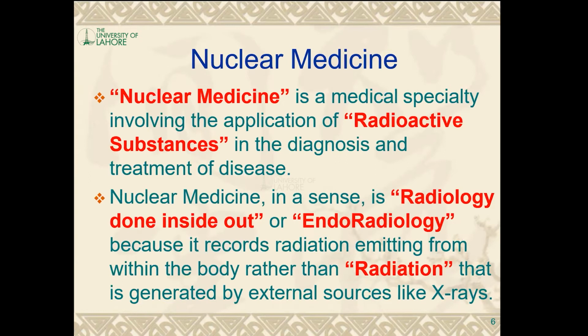The reason it's called endoradiology is that nuclear medicine records radiation emitting from within the body rather than radiation that is generated through an external source like conventional X-rays. As you know, if we talk about conventional X-rays, we produce radiation or X-rays from an external source like an X-ray tube, whereas nuclear medicine emits radiation from the body, not through an external source.